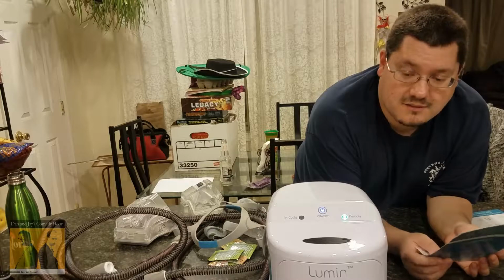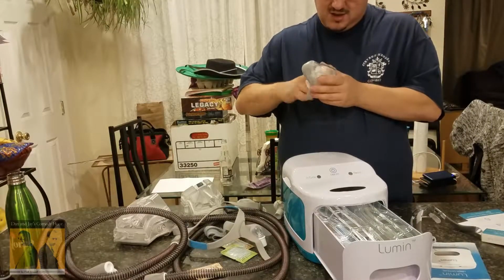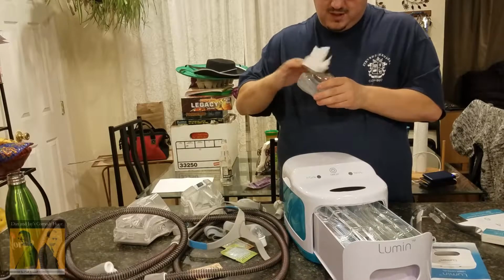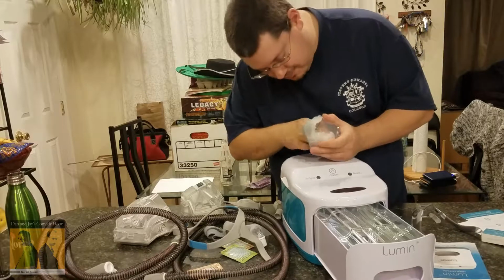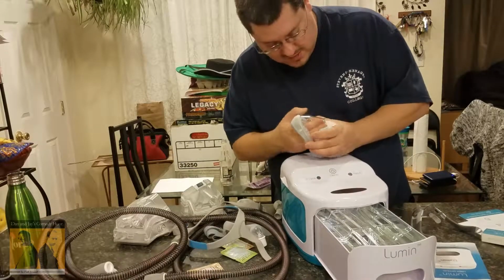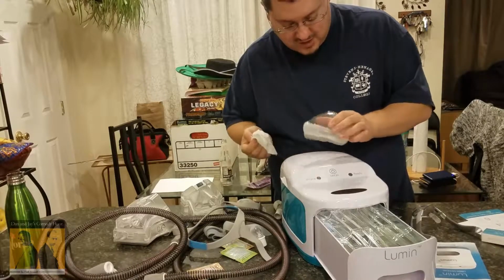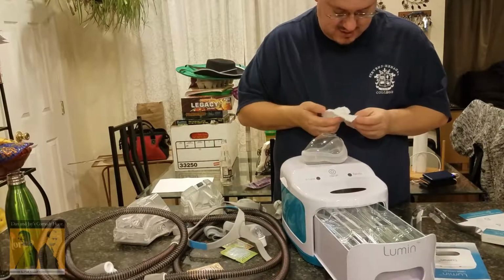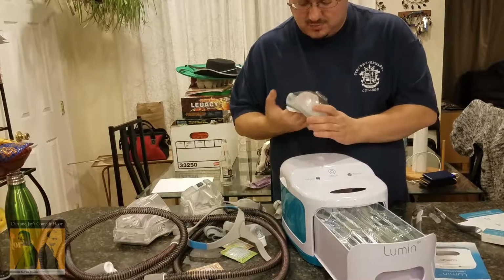Hey, it's done! We'll wipe that down, because it's definitely got a lot of nose grease in there. Gross. Definitely, the facial thing on my last mask, I was getting pretty close to when I needed to get a new one, and it was getting really gross and smelling bad. And we tried to wash it, and it fell apart. It wasn't great.